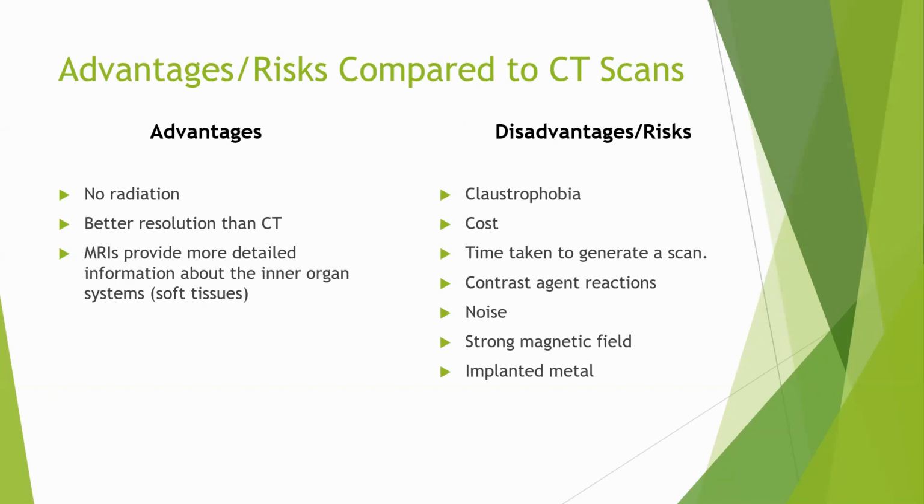And the rest of the stuff: implanted metal, prosthesis. If there is any inbuilt prosthesis, you cannot do MR. So please have this in mind. You can write it down. Contraindications: implanted metal, pacemakers and whatnot. Anything that is implanted, you cannot do.